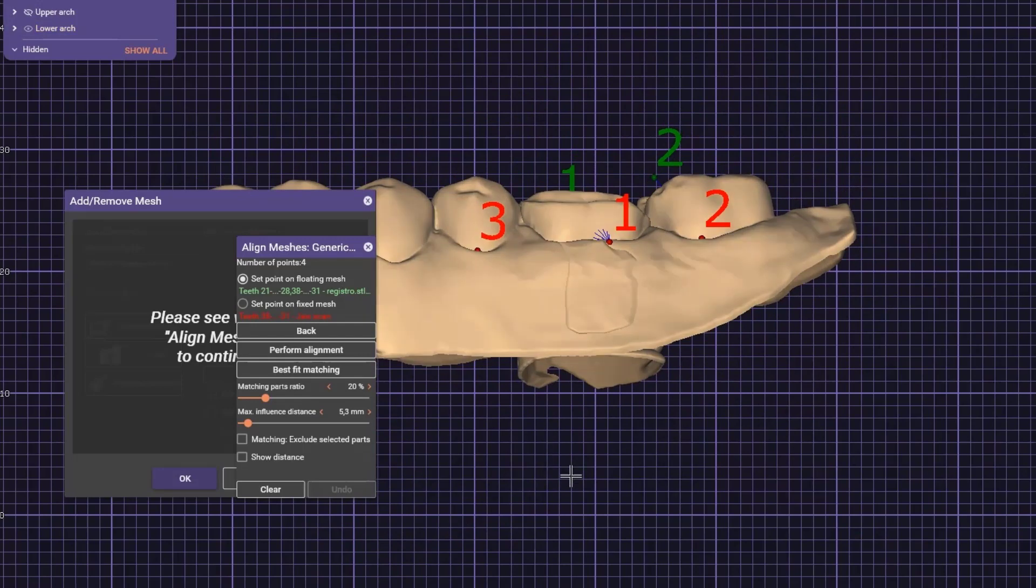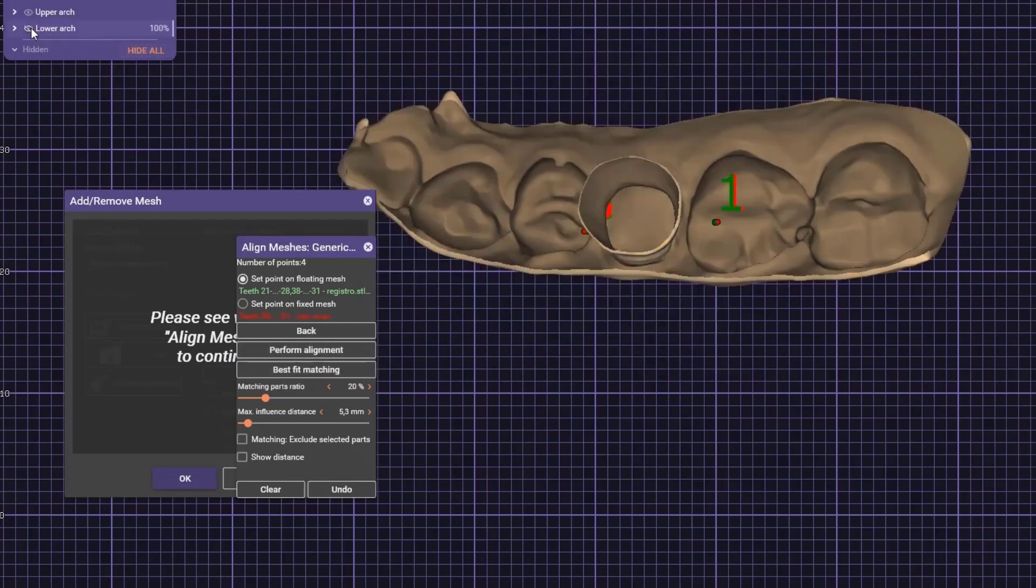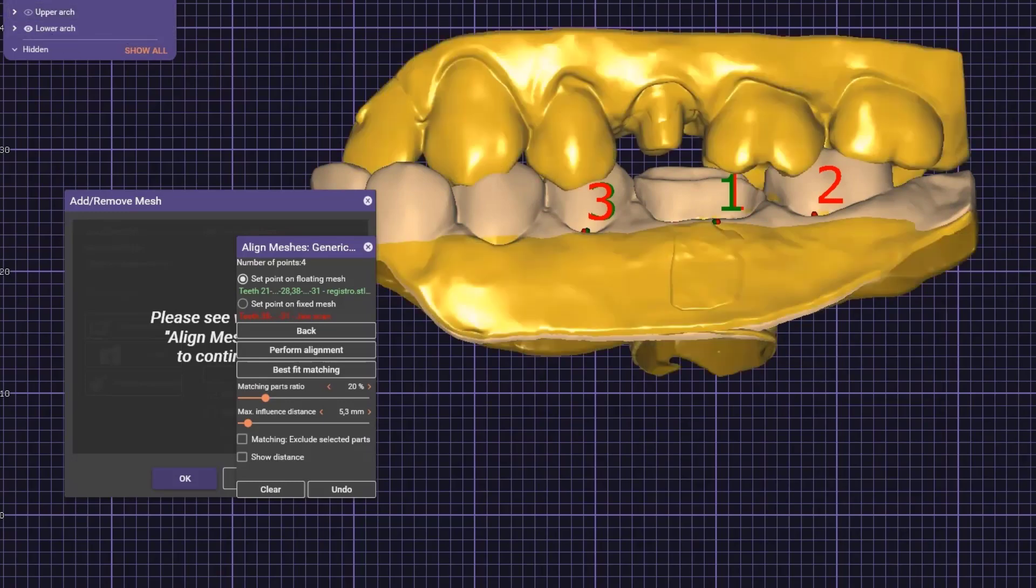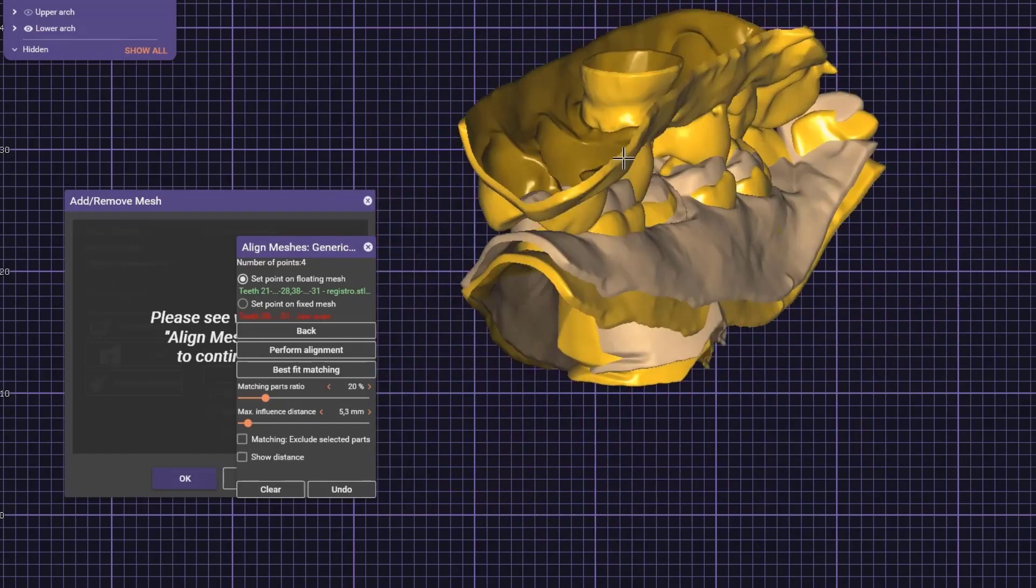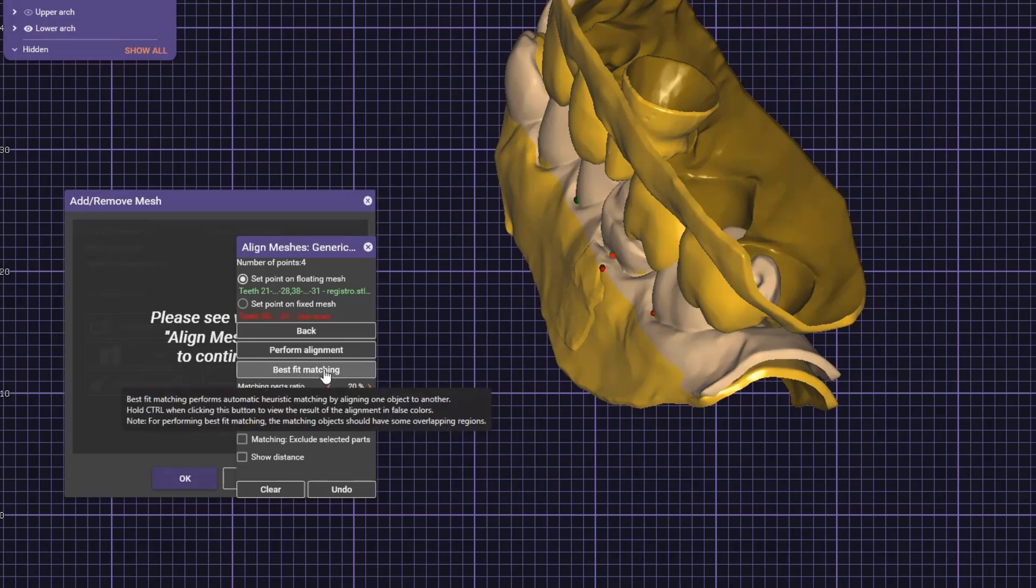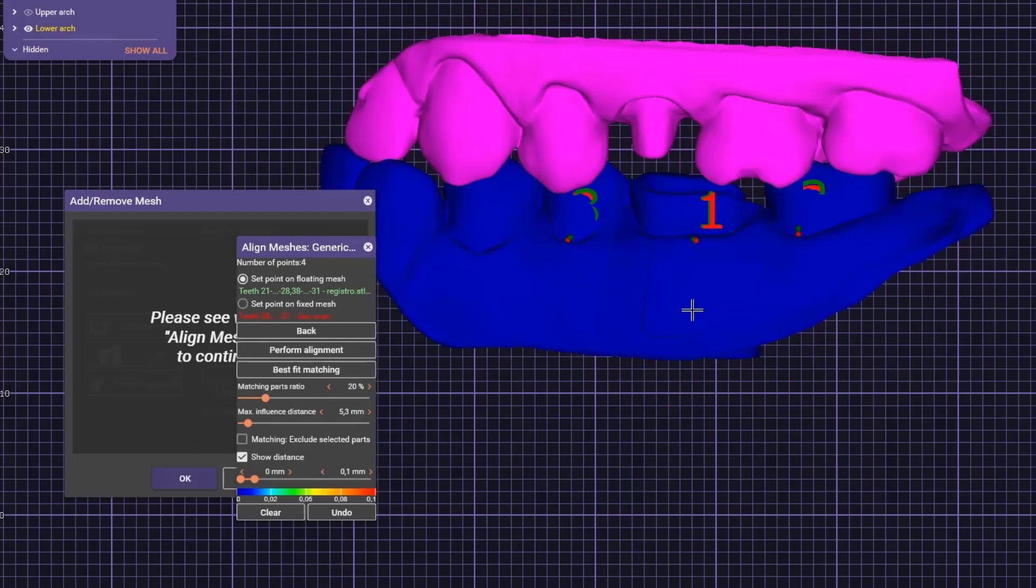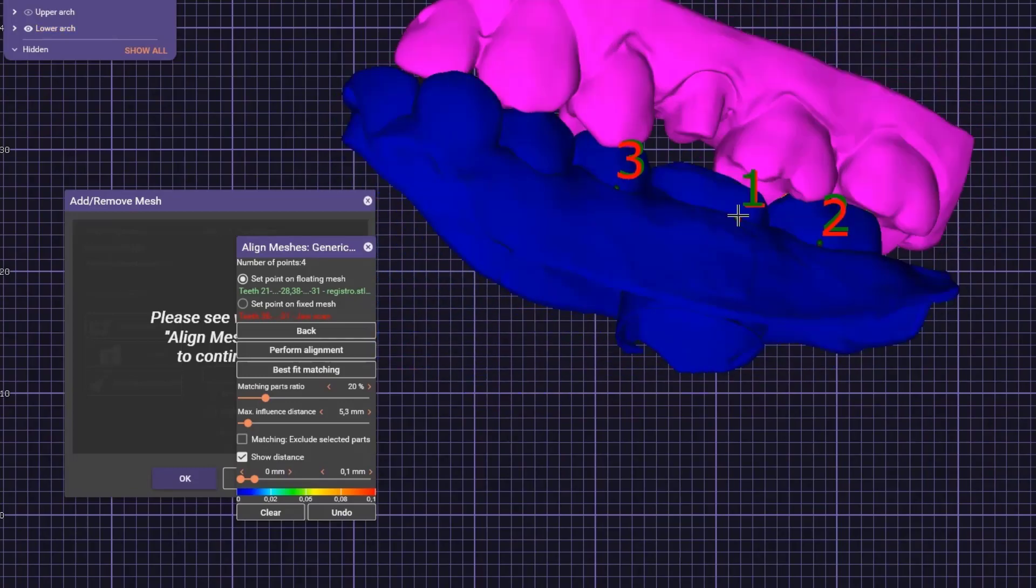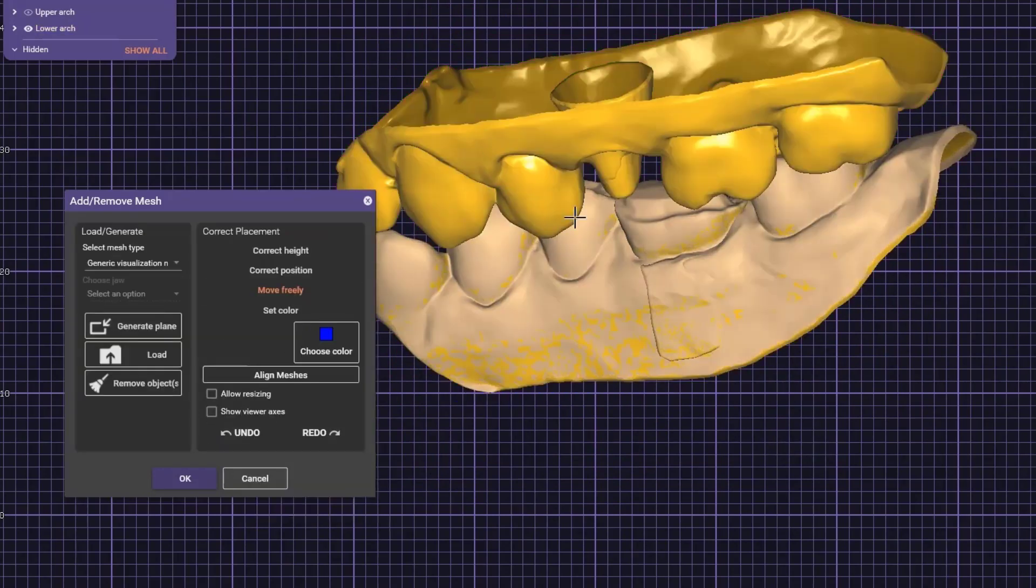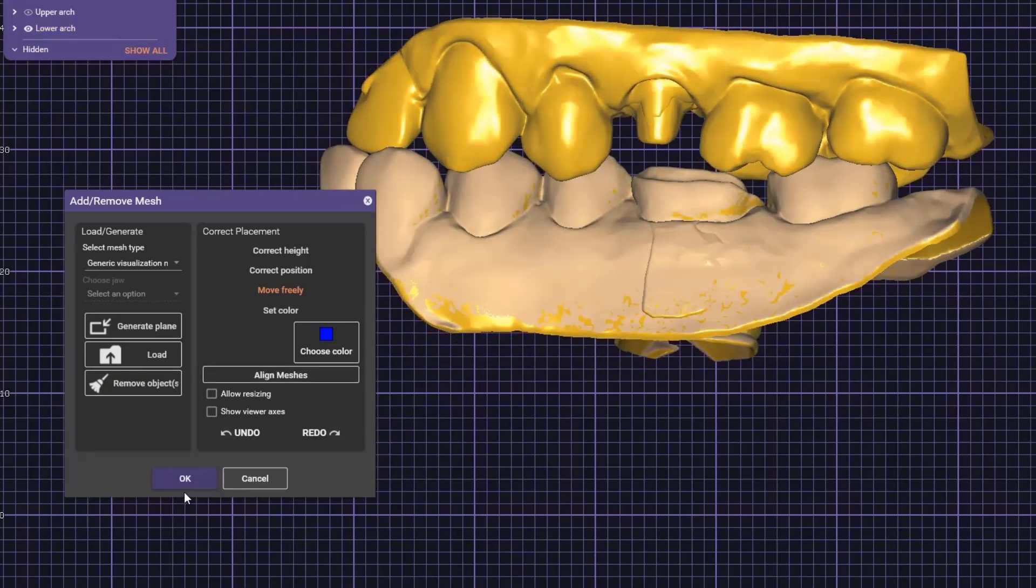Now that we've placed all three points, click on perform alignment. As you can see, it's almost in the same position. To make it perfect, hold control and click on best fit matching. The meshes are in blue, which means they're perfectly in the same position. Hit X, and now it's very important: don't click cancel. Click OK.